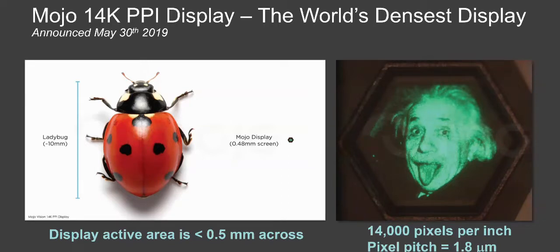So you can see on the left, here's a ladybug. And this is to scale an actual Mojo display chip. The actual lit up area is less than half a millimeter across. But when you look at it under a microscope, you can see what's on the right here, which is a nice picture of Albert Einstein.